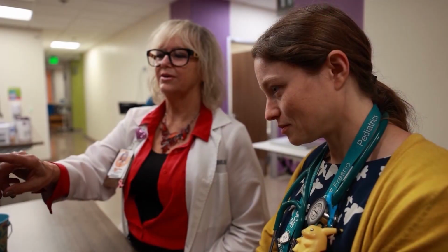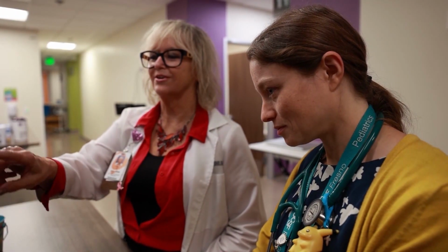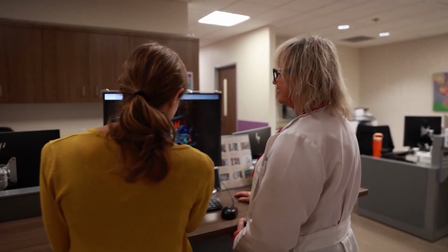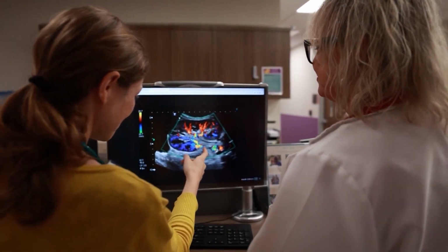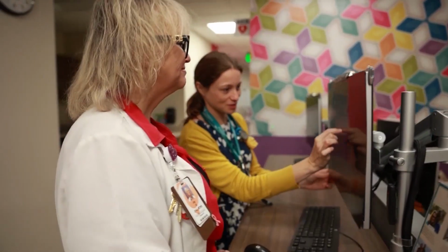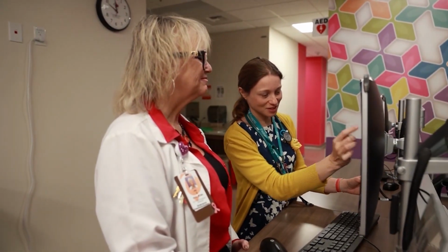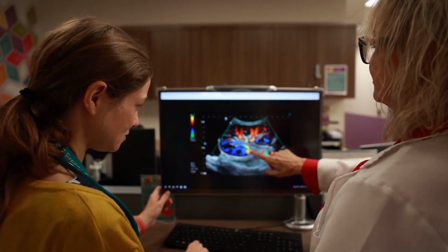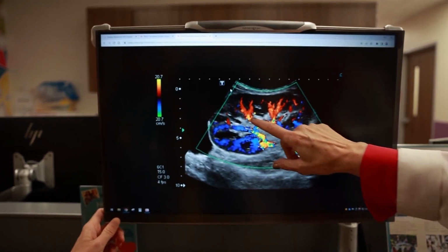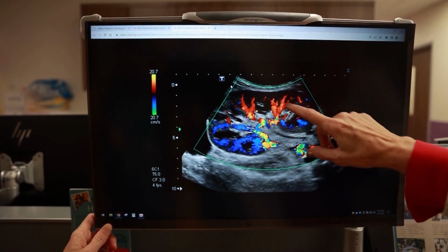To help address this growing problem, Community has implemented ambulatory blood pressure monitoring, or ABPM, for pediatric patients, a device children take home to help monitor their blood pressure. It takes a blood pressure reading a couple of times during the day, and it also checks while you sleep. And it gives us a really good idea of what your blood pressure is over a long term. This technology helps diagnose in addition to other tests.